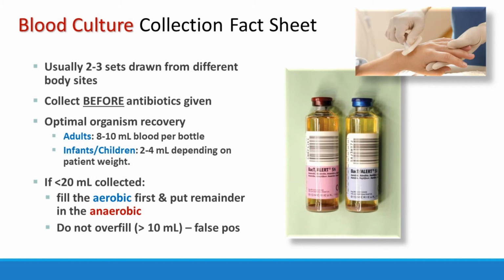So obviously with more blood volume, we will have that CO2 reaction happening sooner, and we will be pulling the bottle out and working it up and giving you a call sooner. We also only hold them for 5 days, so if we don't have enough blood in there to create that reaction, it could go undetected when there is actually an organism there.